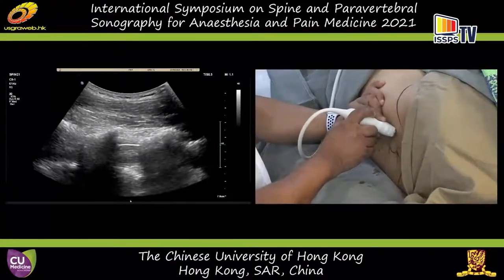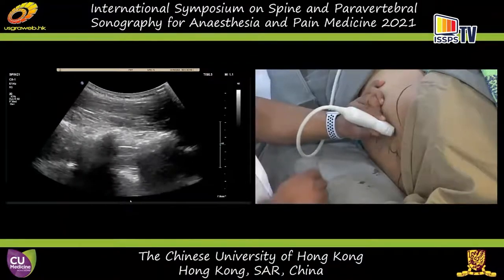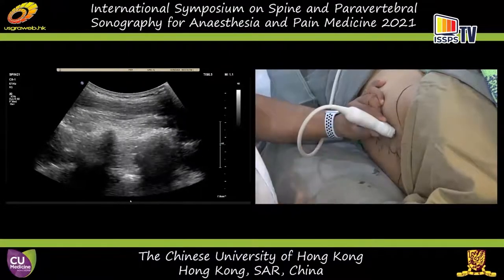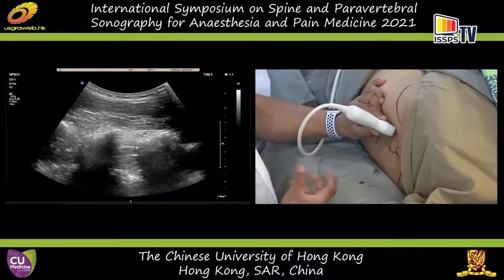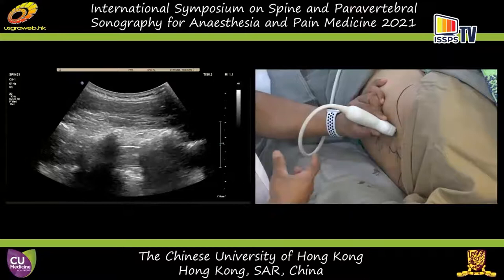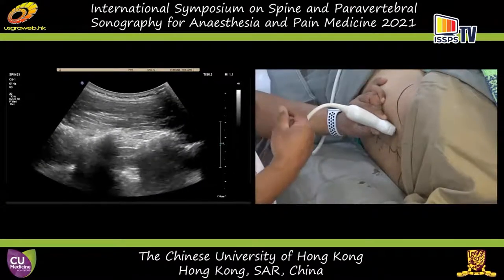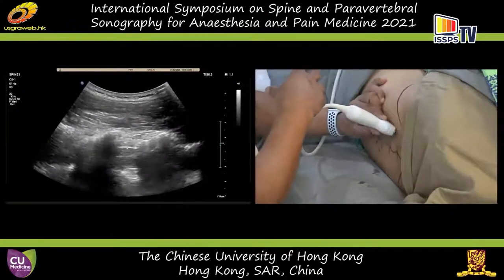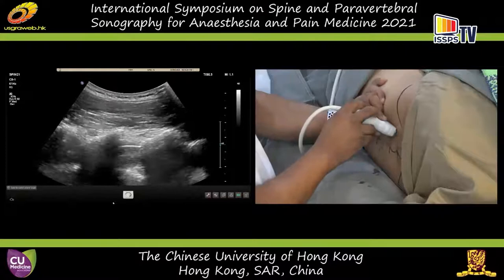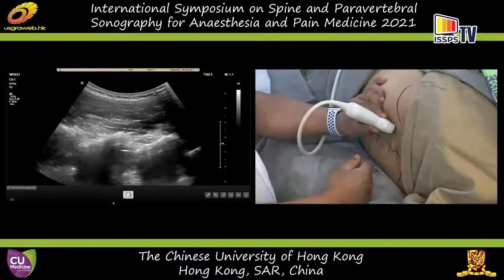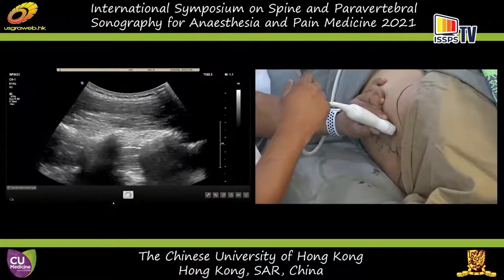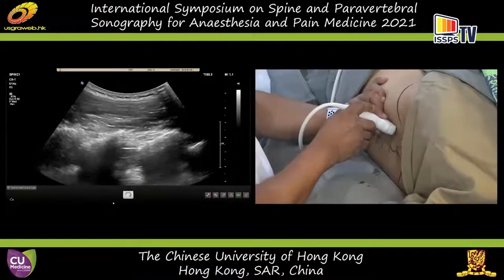Somebody asked about how to detect the position of a catheter in the epidural space. One of the ways is to use Doppler imaging after the injection of saline. It depends where the tip of the catheter is, but imagine your catheter is in this epidural window. If you inject normal saline through your catheter rapidly, you will see a kind of a blush of colors — a turbulent flow within the epidural space. It can also be used for caudal epidural injections to locate the catheter. The limitation is if your catheter tip is in the acoustic shadow, it could lead to a false negative.